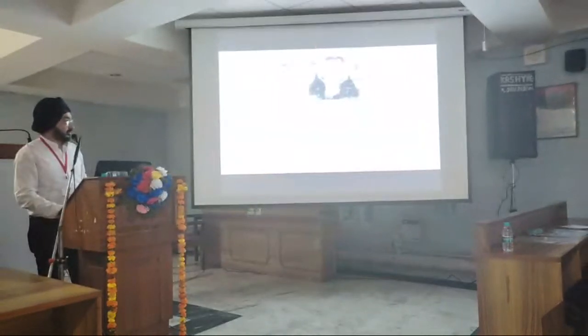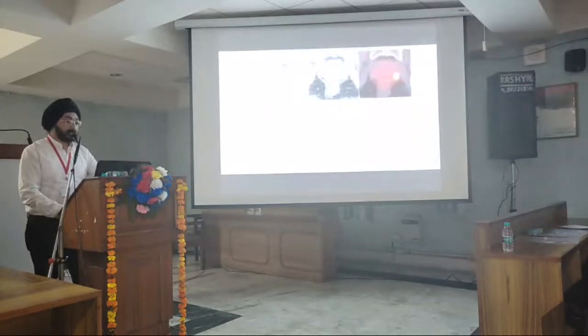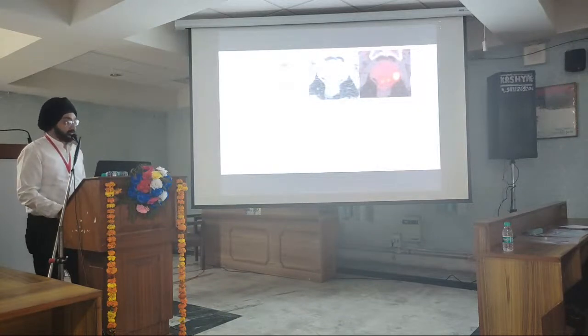If we see the cut section of the prostate, we can see different zones: the peripheral zone, transitional zone, and the central zone. They cannot be easily differentiated on CT. That can be done on MRI. But on PSMA PET, we are able to make out the lesion. So we can say approximately it's the left peripheral zone, with fibromuscular stroma involvement. You do not see the capsule. MRI will be more accurate for T staging, but still you get approximate ideas, especially in cases in which you get definite evidence of infiltration.